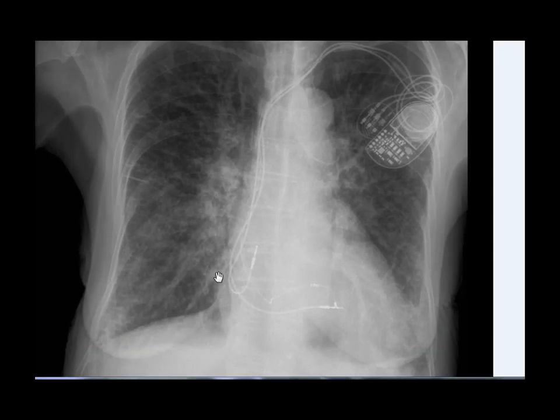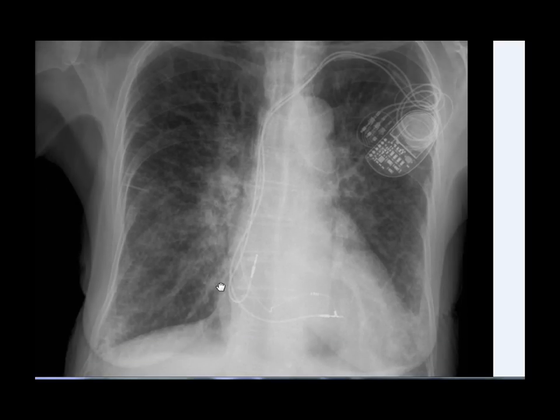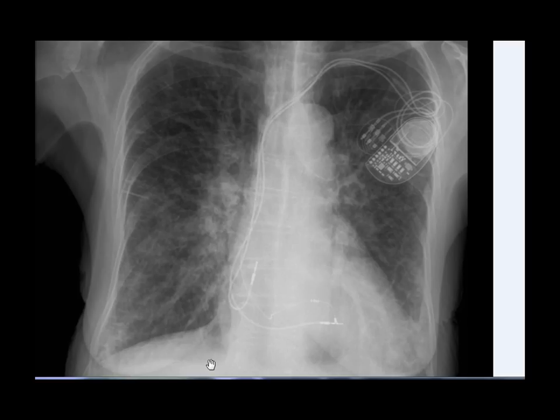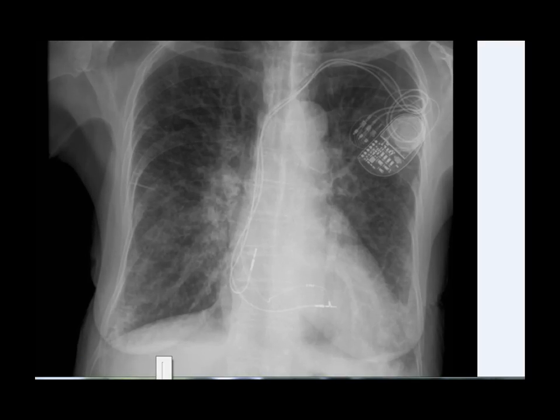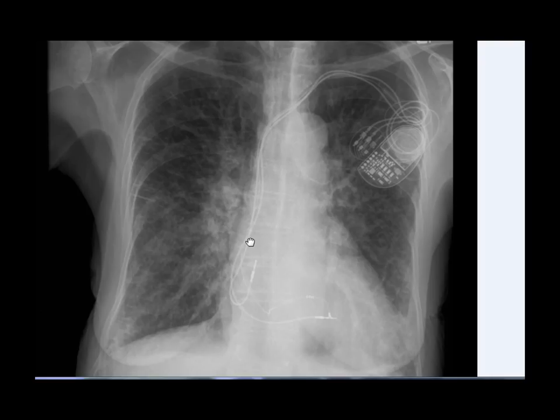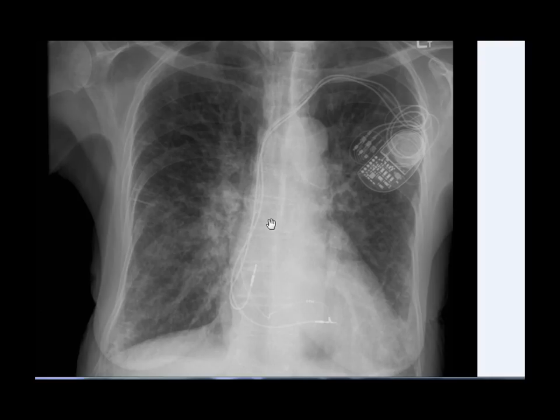This X-ray is a good example showing all the radiological features of increased pulmonary venous pressure. Take a few seconds to identify features of acute left heart failure. The first sign is perihilar haze.